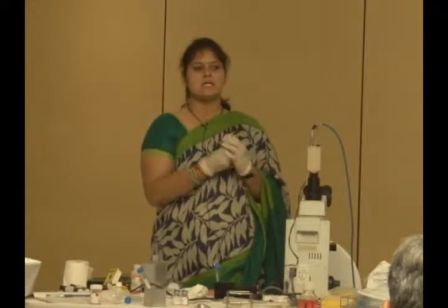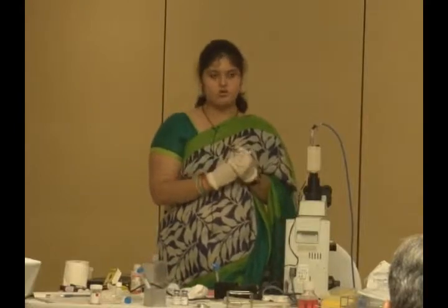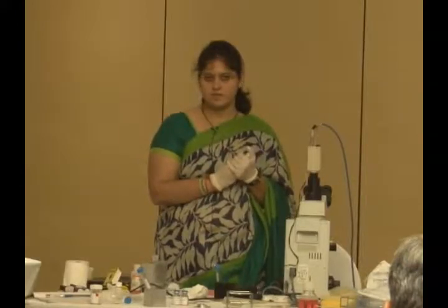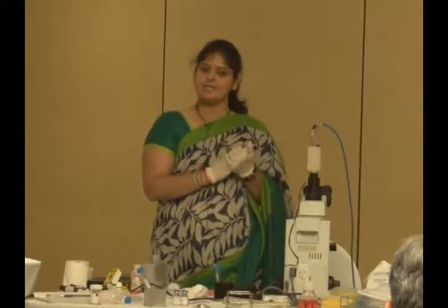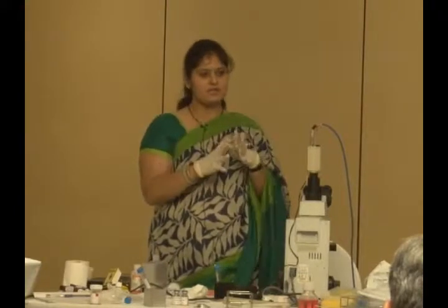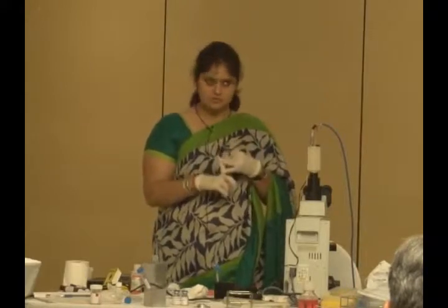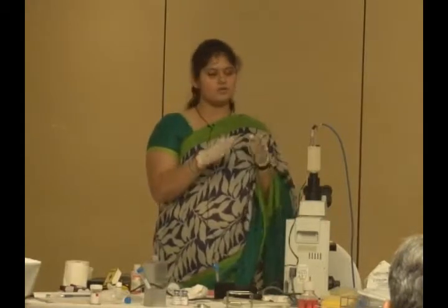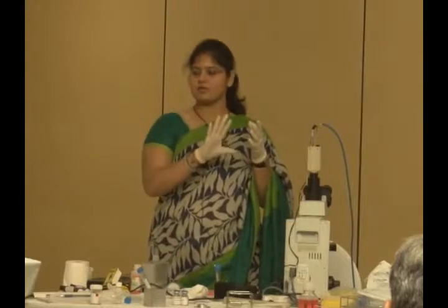Now one thing which I would like to say, when you are using the medium for IUI, always incubate the medium at least 2 hours prior to the process. It has to be at 37 degree temperature and it will take at least 2 hours to get the uniform temperature. That is the reason whenever you start your work, first thing in the morning you start your heating block and put the medium for incubation. In density gradient, you can prepare the tubes and put them for incubation. If you know that you are going to get 10 patients or maybe 5 patients, prepare the tubes accordingly and put them inside the incubator.